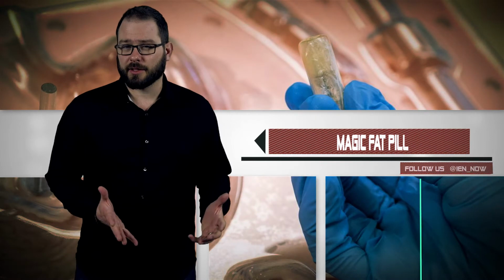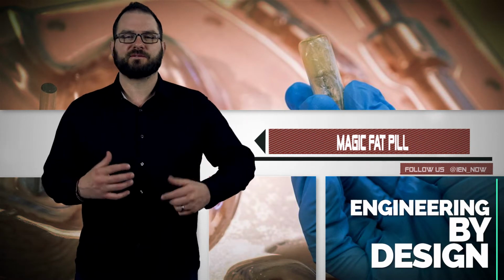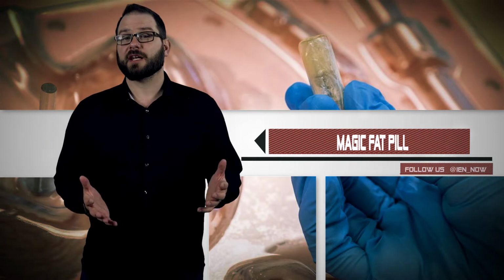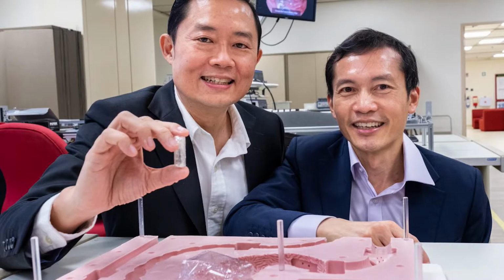Researchers from Nanyang Technological University in Singapore have done it! They've created a magic pill that fights obesity. The team has designed a pill that inflates in your stomach to make you feel full. They call it the EndoPil.